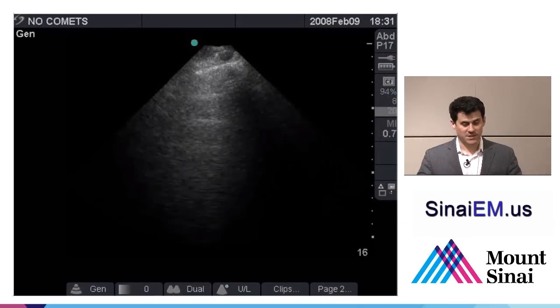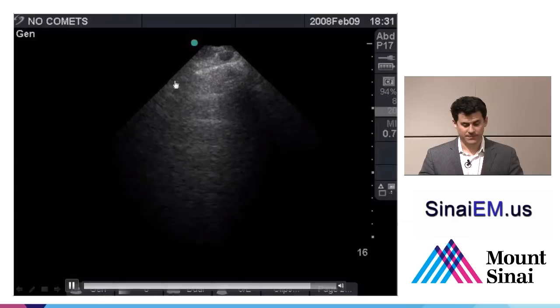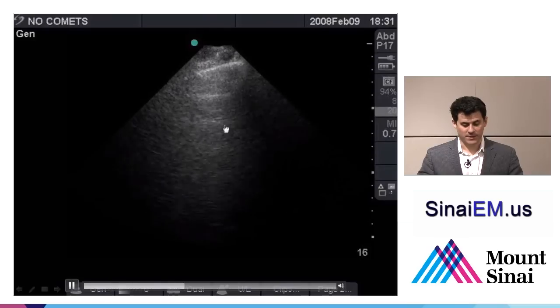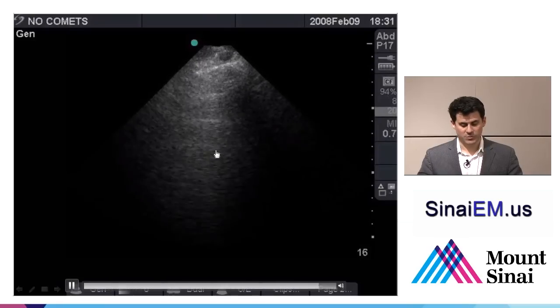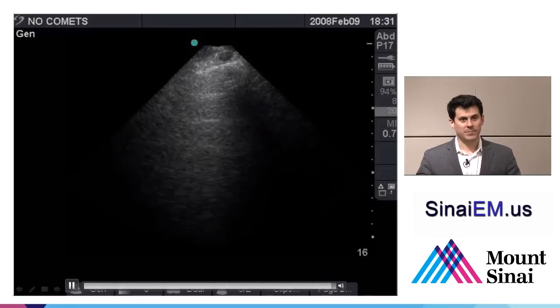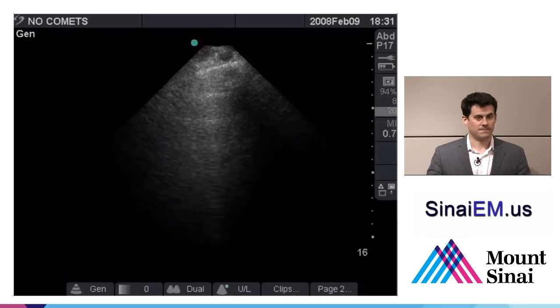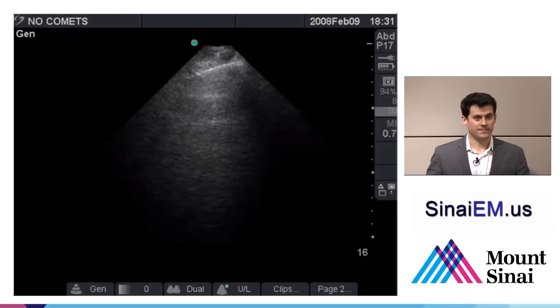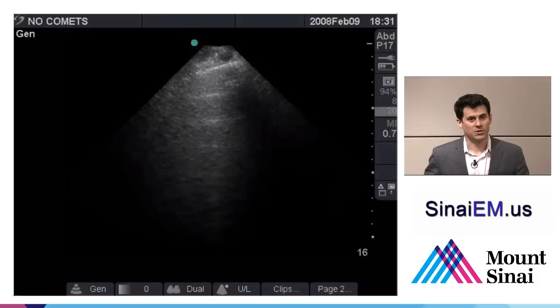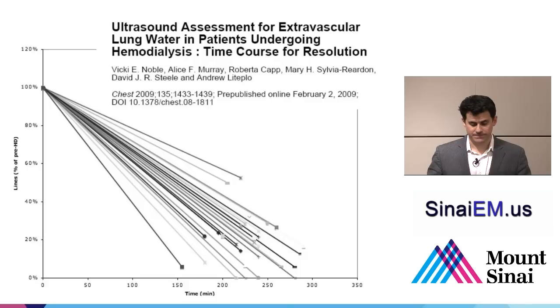In contrast, we see here no B lines. We see the pleura near the top of the screen. We see a reflection of the pleura, another reflection, and maybe without too much imagination, we can see at least a third one down there. So this repeating pattern, equidistant from the pleura to the skin, is A-lines. No pulmonary edema, also no consolidation, but that's a talk for another day. Normal lung parenchyma at this location.